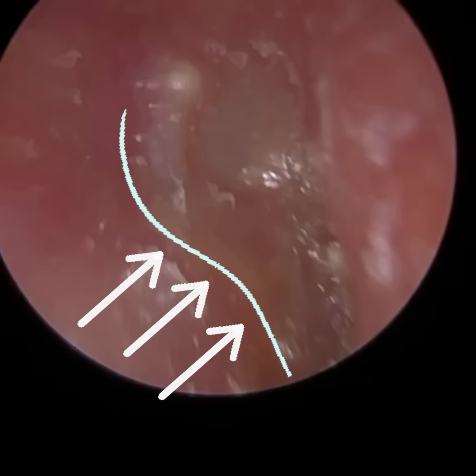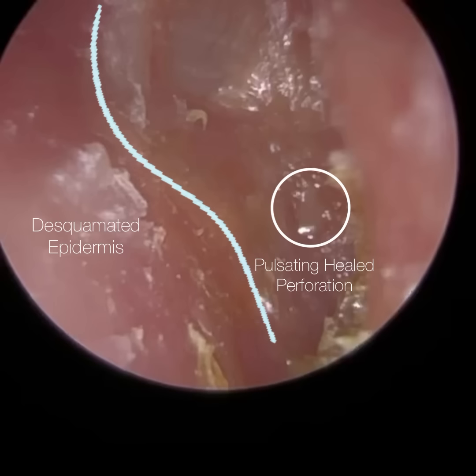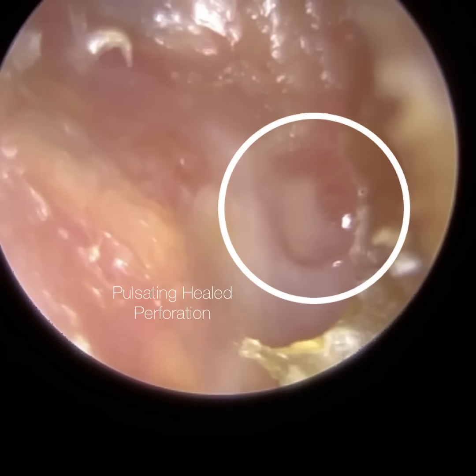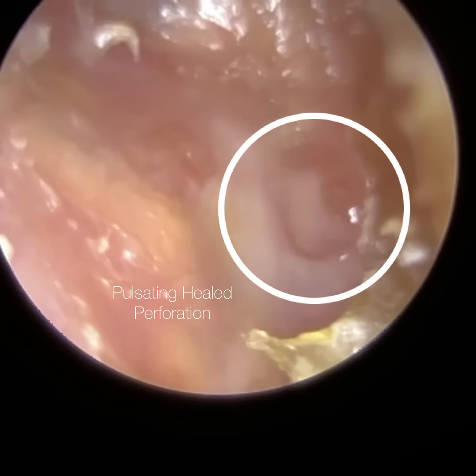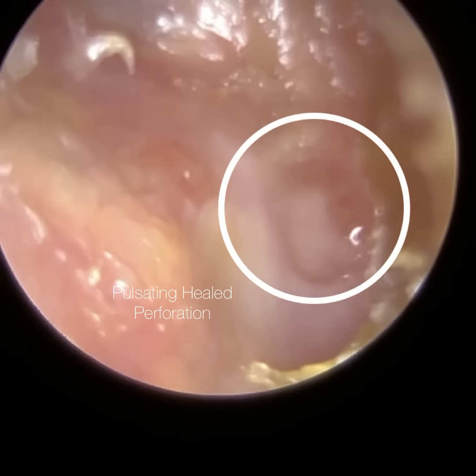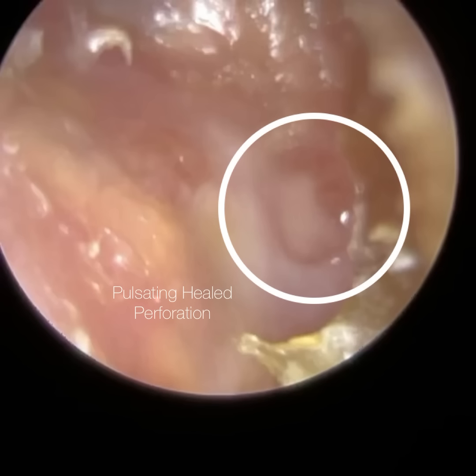So that's the curvature of the posterior medial canal walls. You can see it's kind of bulging outwards there. And again, I've got that outline there. And then to the right, that's the part of the eardrum that's the pulsating eardrum. That's where the hole is, and you'll see it in a minute. It's kind of pulsating there. If it was an active perforation, the discharge, all this fluid behind the eardrum, that's what's causing this pulsing, would be collecting in the ear canal itself, but it's not.